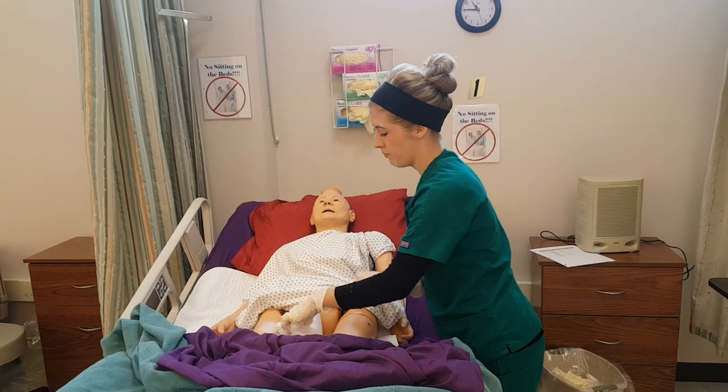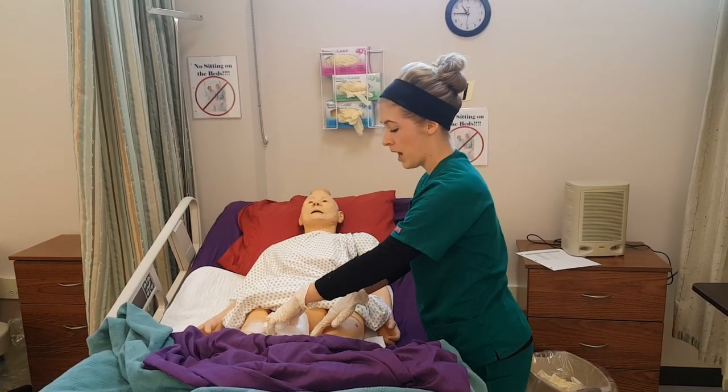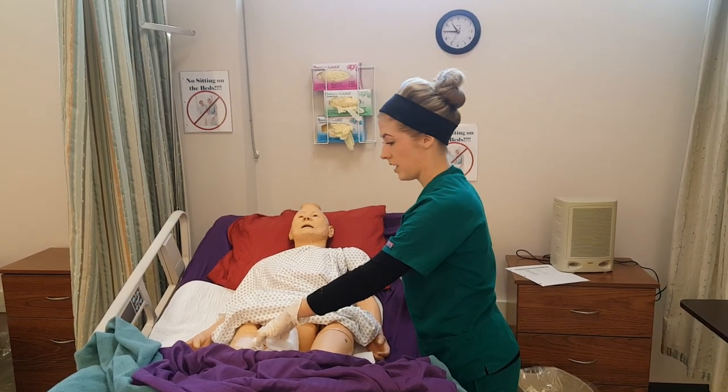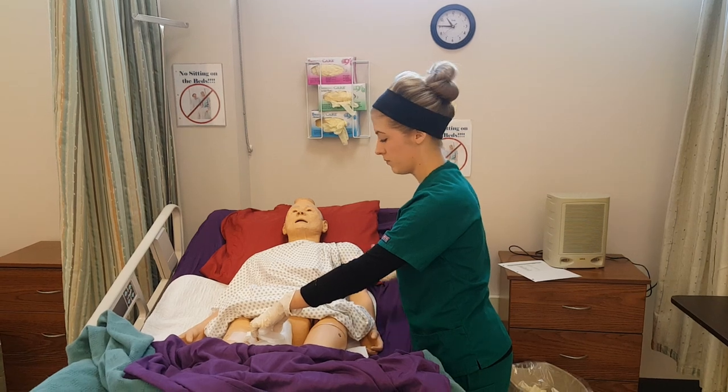Placing this in between the patient's legs. If my patient was able to do this on his own, I would prop this up with a washcloth and make sure that he can reach his call light to let me know when he's finished, and I would leave the room raising the side rail.